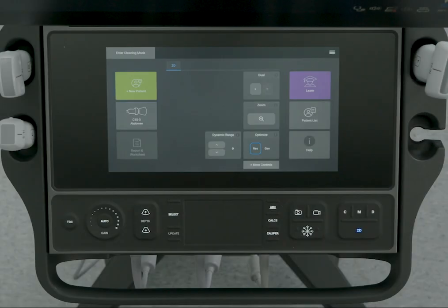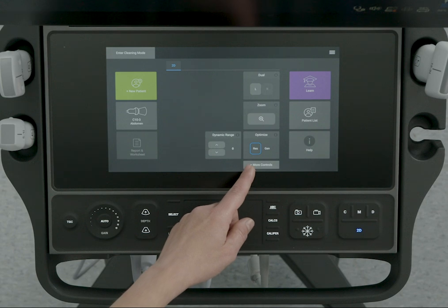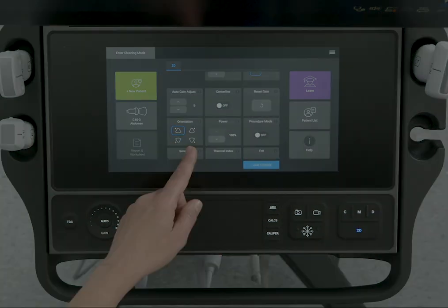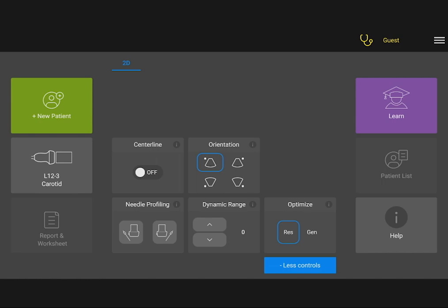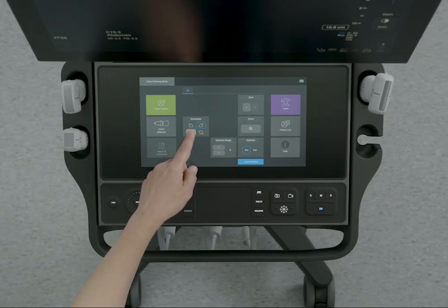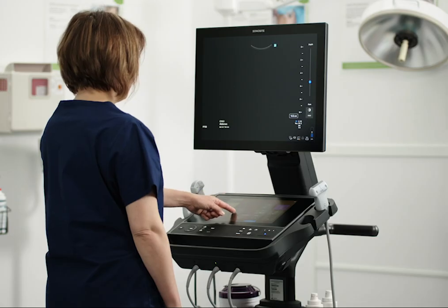Many of the system's image controls are available using the Touch Panel. You can view more controls and even optimize the placement of the controls to suit your needs. Tap the icons on the Orientation control to adjust where your image is on the screen.